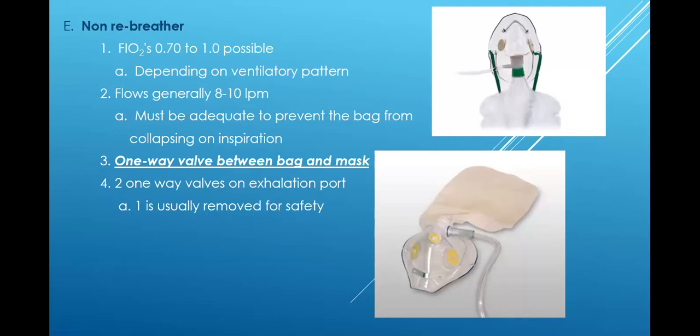Now, this lab, I think, is in the module. The lab that I did on low flow and high flow devices is in the module. So as you study, you need to be watching these labs so you can see me hook it up, because you're going to have to be able to have this stuff on the table. And I tell you, okay, show me a partial rebreather. You have to be able to get it. Show me a non-rebreather. Show me a nasal cannula, right?